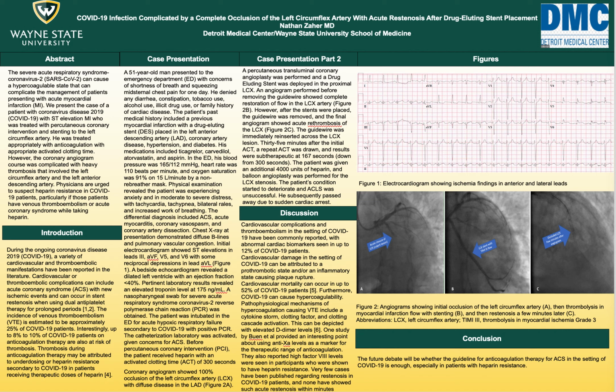His activated clotting time, or ACT, was checked and came back at 300 seconds, which is therapeutic. Just as a side note, activated clotting time is similar to PTT. It's just a metric that we use at the Sinai Grace DMC campus.